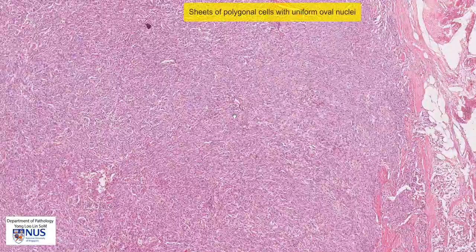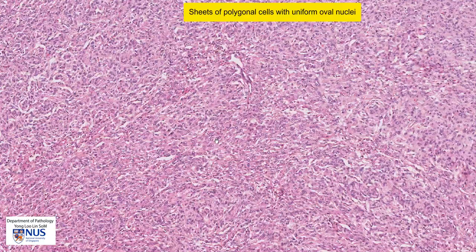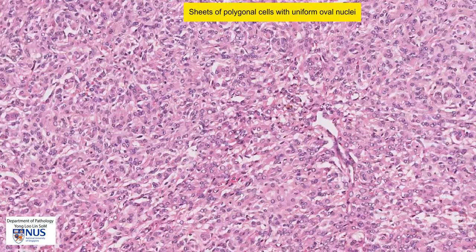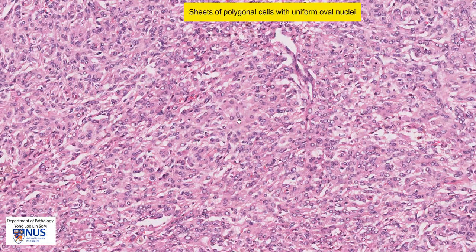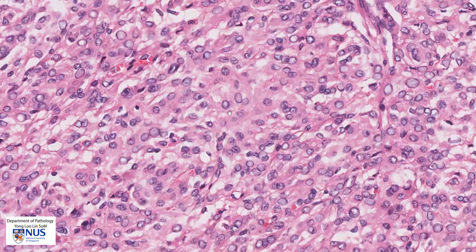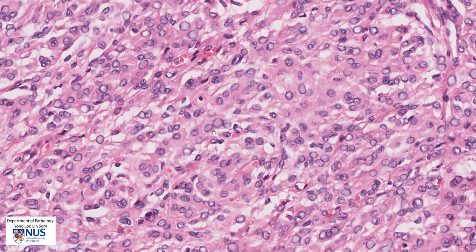The tumor itself is composed of sheets of polygonal cells with relatively uniform oval nuclei. We can see the individual nuclei that are quite similar in size and shape, and if we were to draw a line around the outline, we can see that the nuclear membranes are generally very smooth.